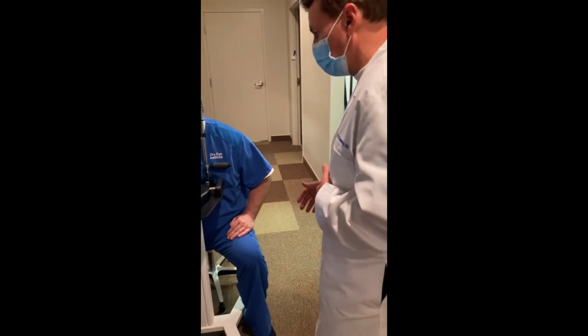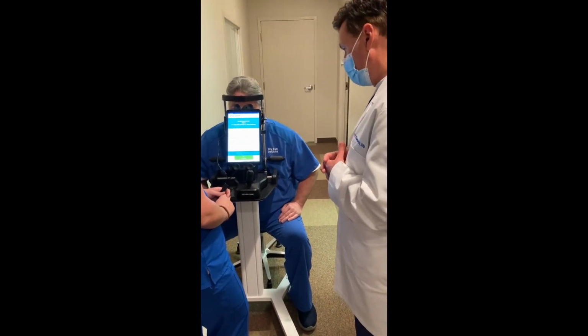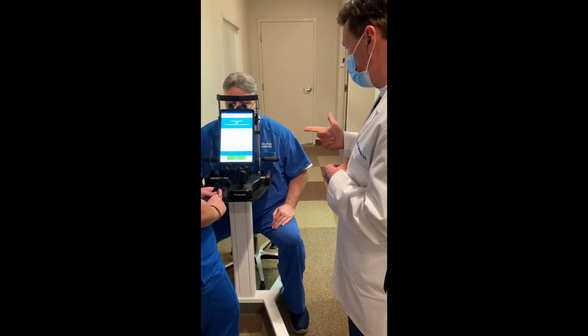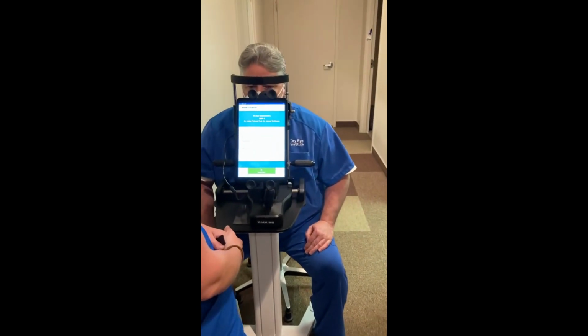So in this case, I'm going to ask the patient, have you experienced any of the following during a typical day of the last month? Eyes that are sensitive to light. Constantly, mostly, often, sometimes, or never. Sometimes. Blurred vision. Constantly, mostly, often, sometimes, or never. Sometimes.